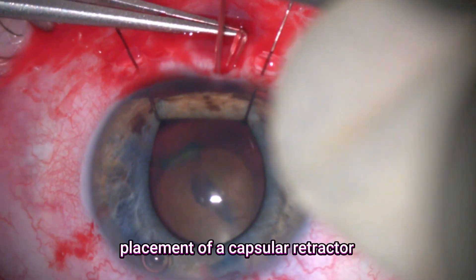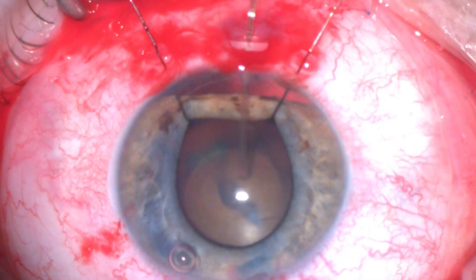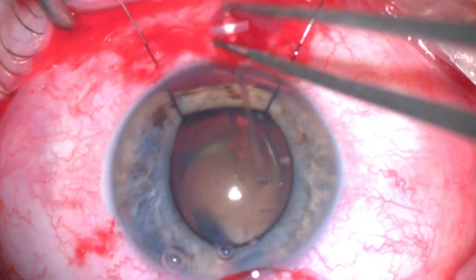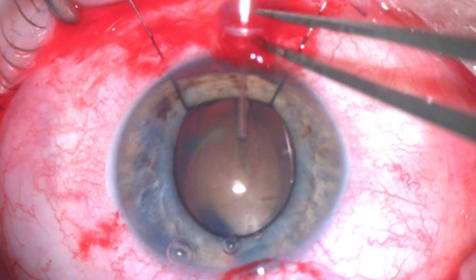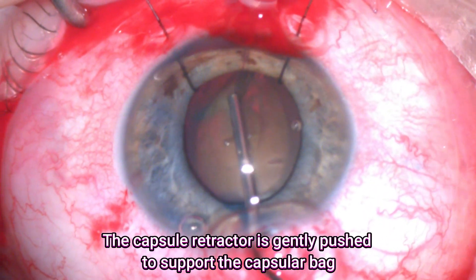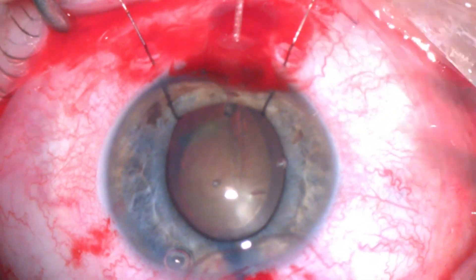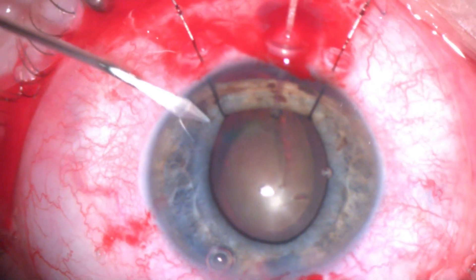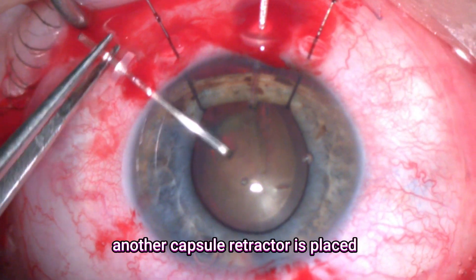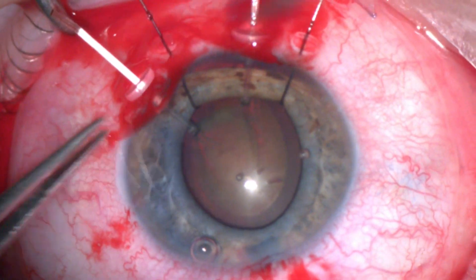Then I decided to place a capsular retractor. This is a very useful tool to stabilize the area of the zonular weakness. They give good support to the whole capsular bag complex. I'll inject a little bit of viscoelastic and slightly push this capsular retractor to center the capsular bag complex. I further decided to place another capsular retractor to give extra support, as I felt there is a large area of zonular weakness.